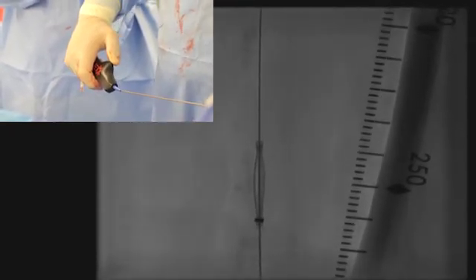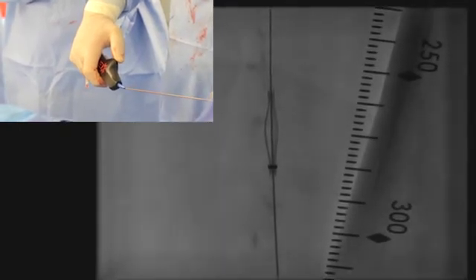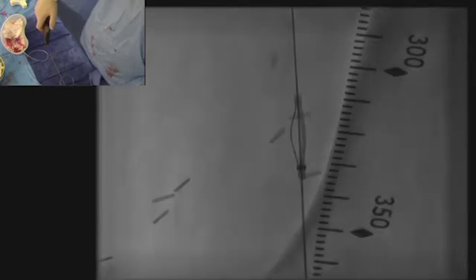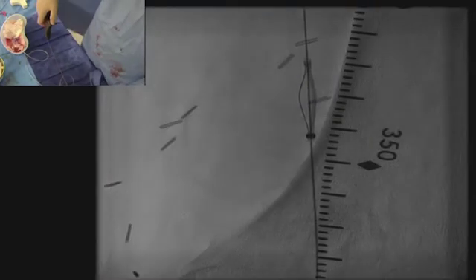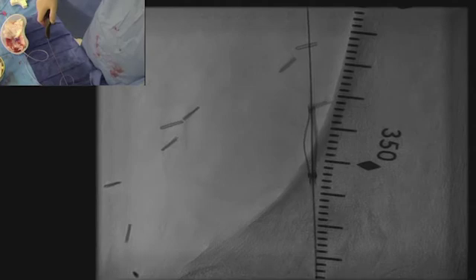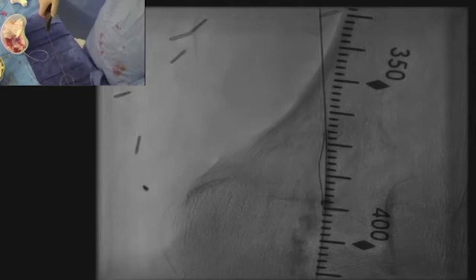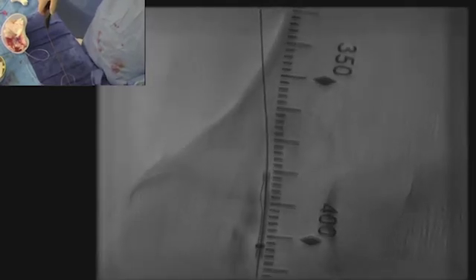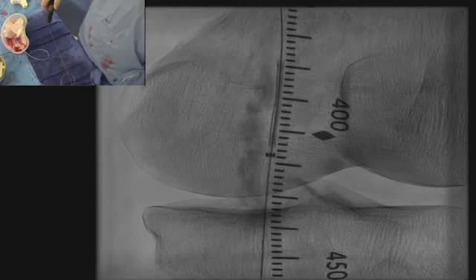Notice here that they have done a great job staying within the lumen. On the left side of the screen, you see that there is more contact with the vessel wall, and you see that it was freed now. Now you see the opposite on the right side, where there is more contact between the flex and the vessel wall, and that actually is being active and doing a great modification of the vessel wall as we pull. Don't let that be a detour when you see one area flexed out and one area flexed in. That's okay. That means the area that is flexed in is doing more work.